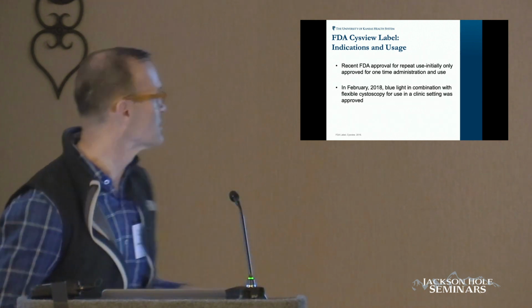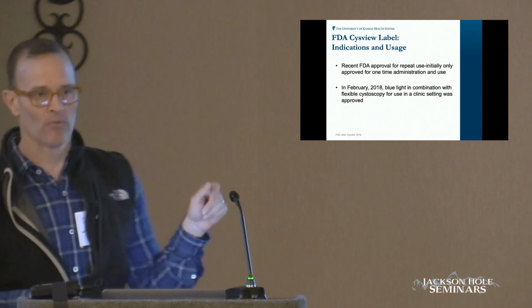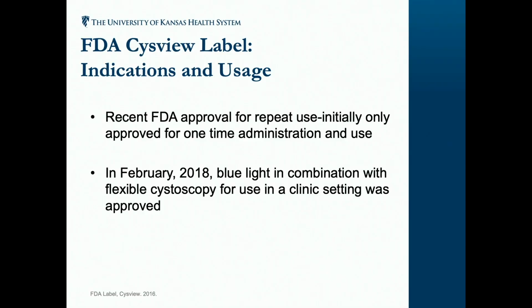It's still important to do those things. It really wasn't until about two years ago that the FDA allowed us to use it for repeat use. You could only use it once, and then they said you can't use it again. That's now changed. There was some concern maybe you couldn't give the dye safely more than once, and we've put that to rest, so you can utilize this multiple times.